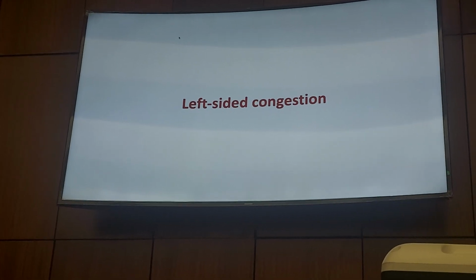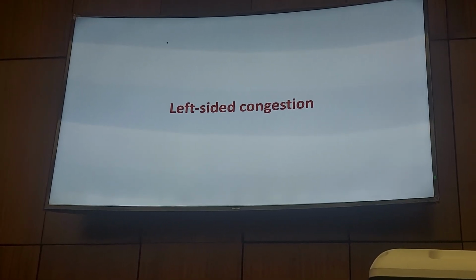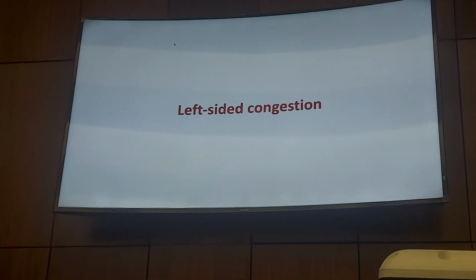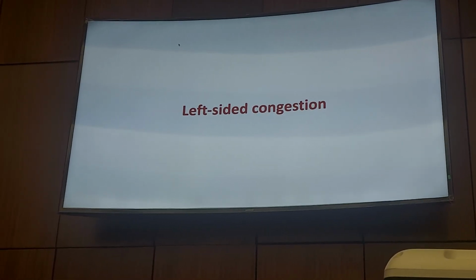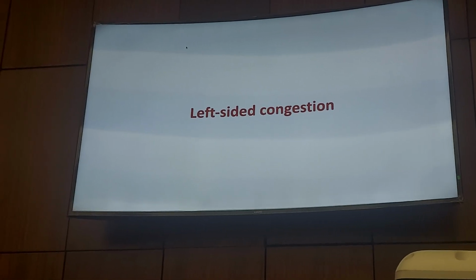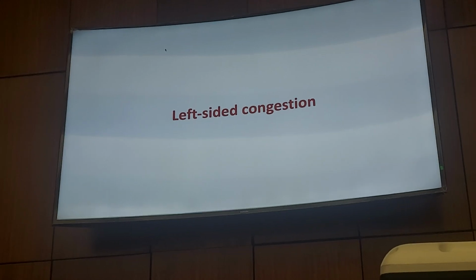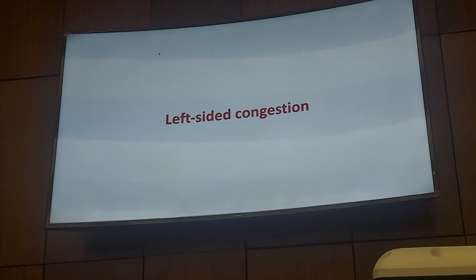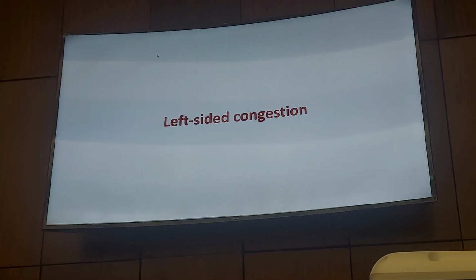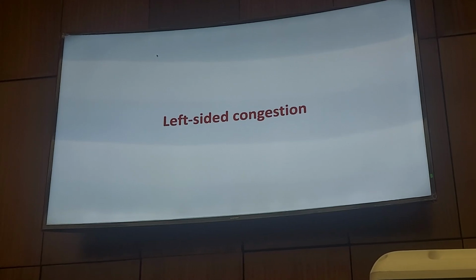But even if these parameters are intra-abdominal, they are still reliable, and that's why the validation study included more than 200 patients after cardiac surgery. I didn't mention ventilation, by the way. Half of them were mechanically ventilated, and half were spontaneously breathing. And there was an agreement across the validation protocol that it correlated well with systemic venous congestion.